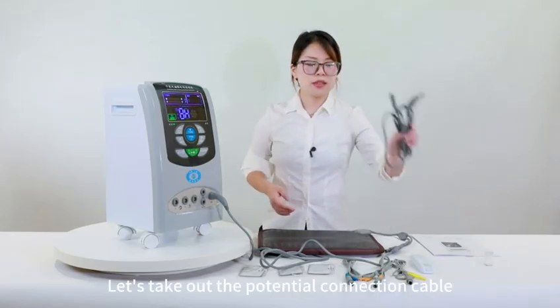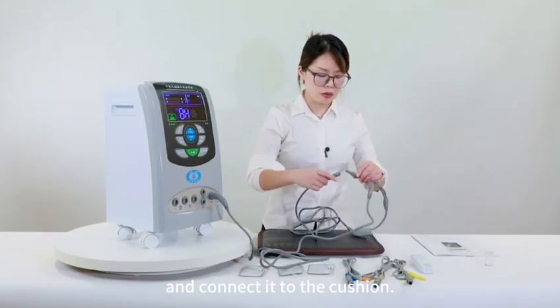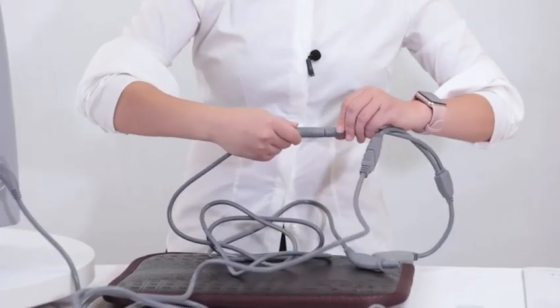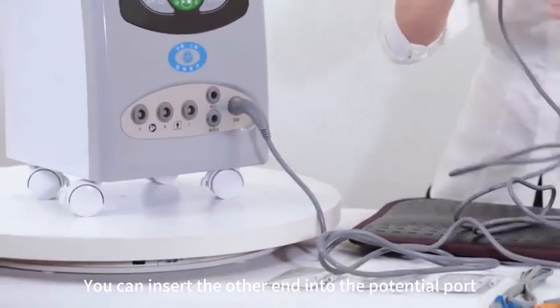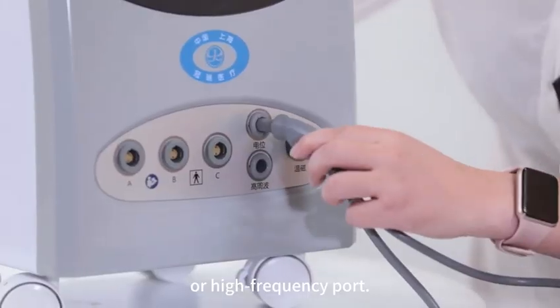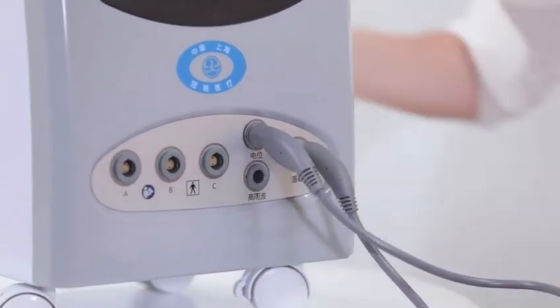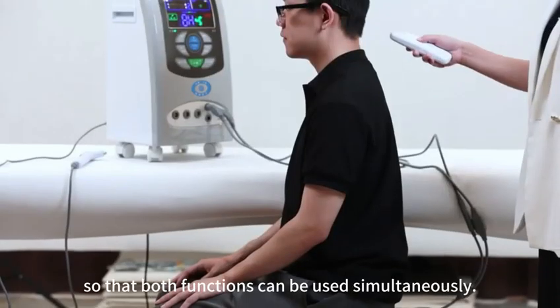Let's take out the potential connection cable and connect it to the cushion. Okay, the potential connection line is connected. You can insert the other end into the potential port or high-frequency port. In this way, both functions can be used simultaneously.